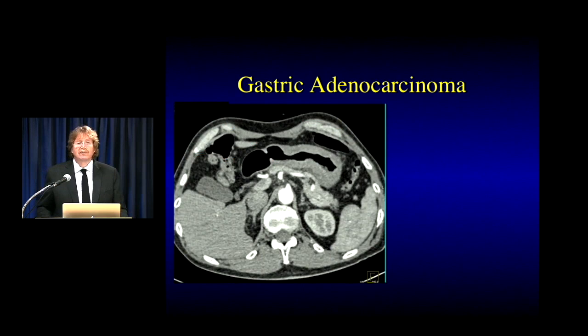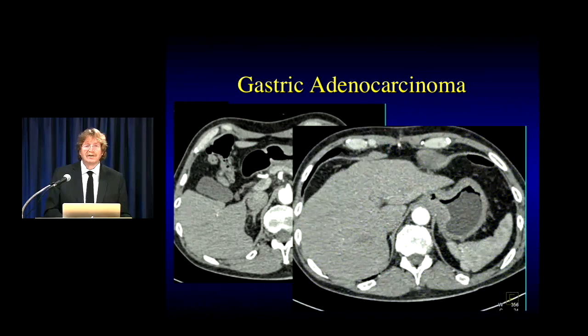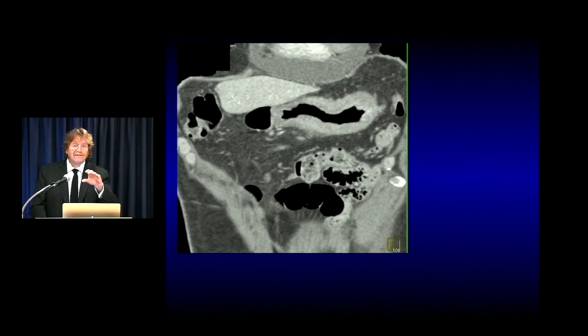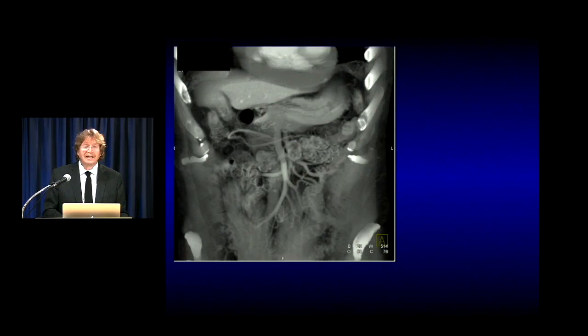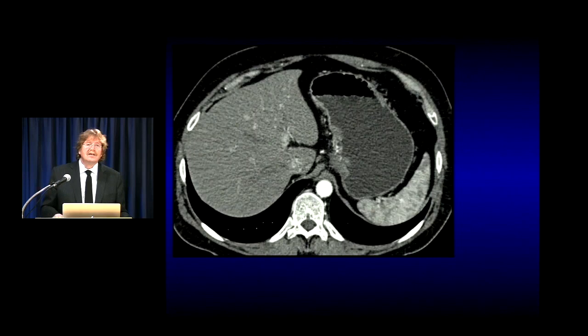Another case describes what's best called linitis plastica. You might say it's just wall thickening or underdistension, but you gave enough oral contrast. Looking at the coronals, there's diffuse infiltration — a beautiful example of linitis plastica. Primary gastric cancer can present with linitis plastica; metastasis from breast cancer can also present with linitis plastica.